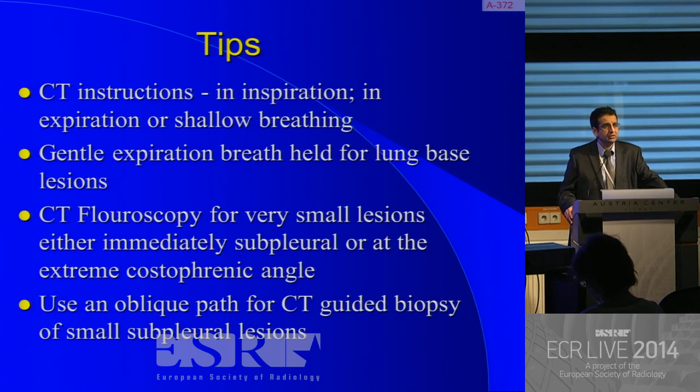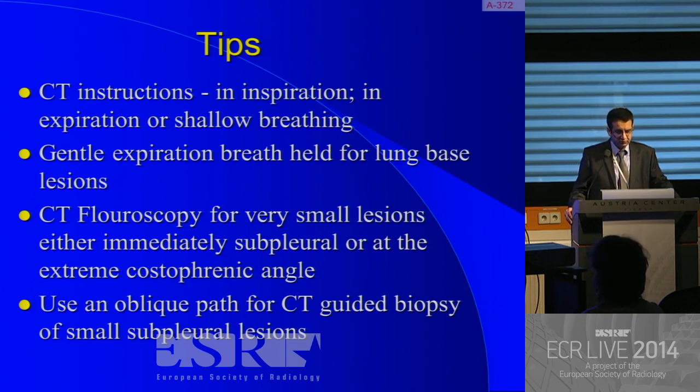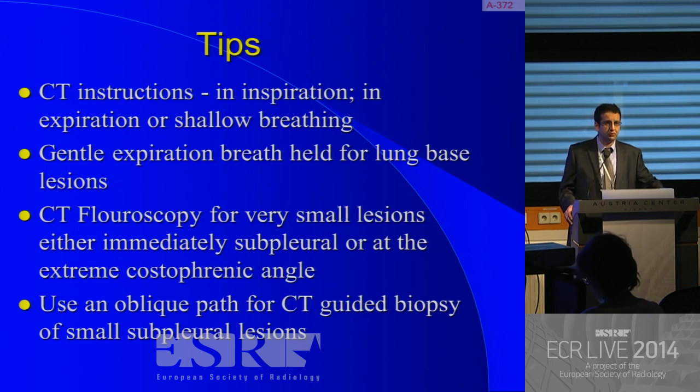Some tips for CT biopsies now. We can do the biopsy in inspiration, in expiration, or shallow breathing. They all work equally well. Just be sure what you are doing and let the patient know what you expect for them as well during those biopsy maneuvers. For lung bases, I find gentle expiration, breath held to be more useful.